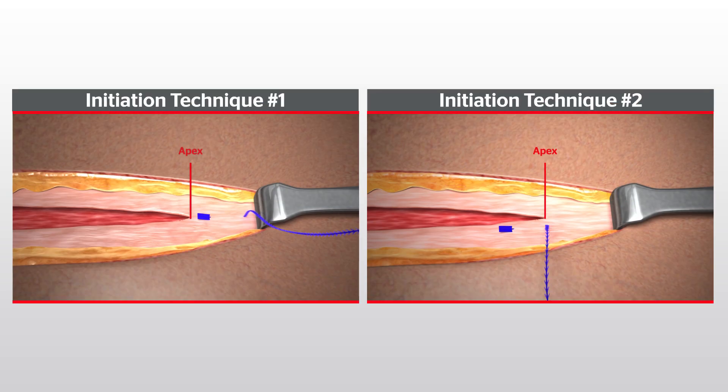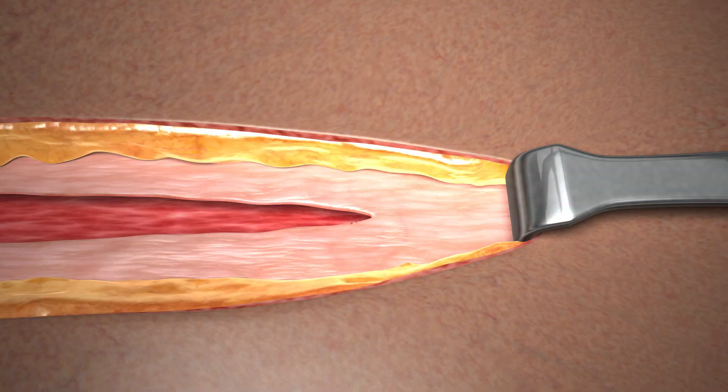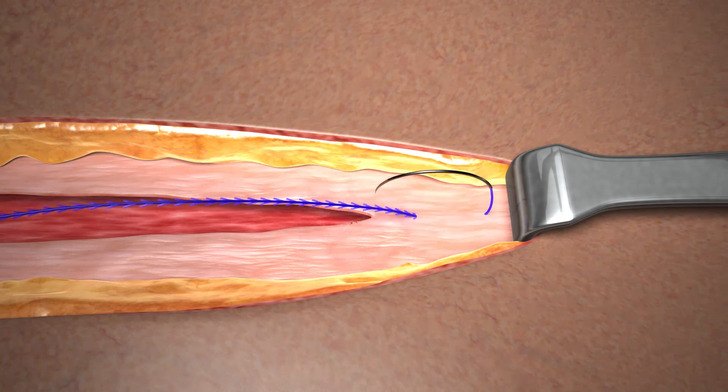The Stratafix Symmetric PDS Plus device is used in a continuous suturing pattern without the need for knots to anchor the suture at the beginning and end of the closure. There are two options for where to seat the tab when initiating the closure. In the first technique, the fixation tab is seated above the apex of the incision.